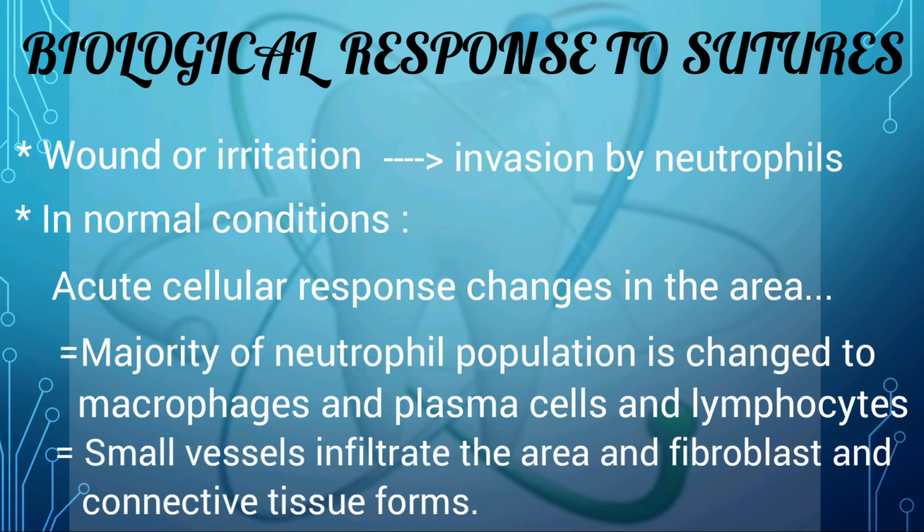Small sprouts of fragile vessels infiltrate the area and eventually fibroblasts and connective tissue proliferate. Assuming the same technique, tissue and other relative factors, the tissue response to all the sutures is relatively the same for the first 5 to 7 days. After this, the response is more related to the type of suture material used.